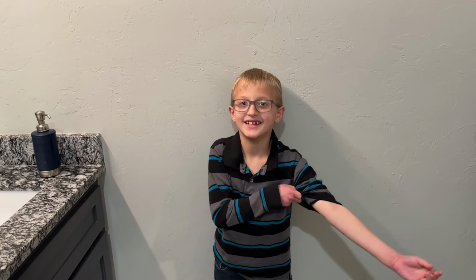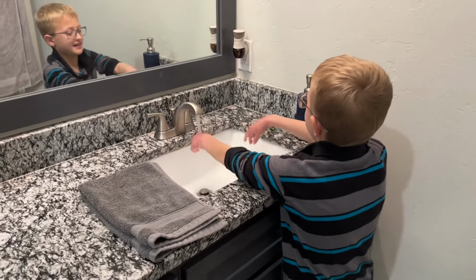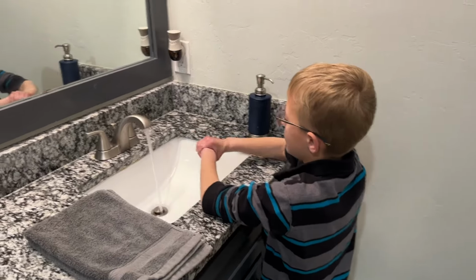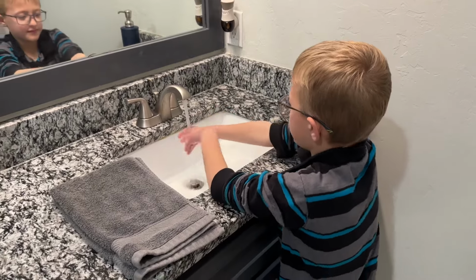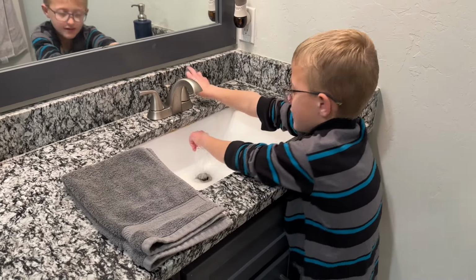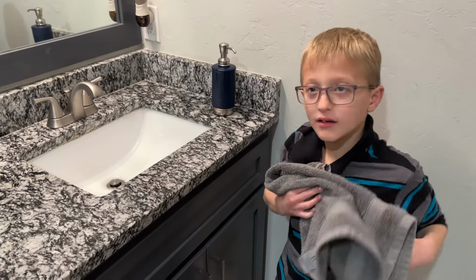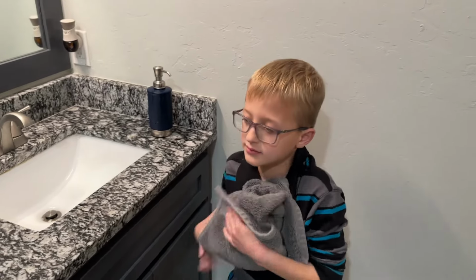So we're going to show everybody how to cath. First thing, what's the first thing we do before we cath? We wash our hands. Great. So go ahead and do that. Now the key here is we call this clean intermittent catheterization. It's not sterile. It's not required to be totally sterile, just clean. So washing our hands is totally sufficient way to get clean, just like you would go to the bathroom and wash your hands after. Here we just do it before and after. So before we touch anything that goes in our bladder, we just want to be reasonably clean.